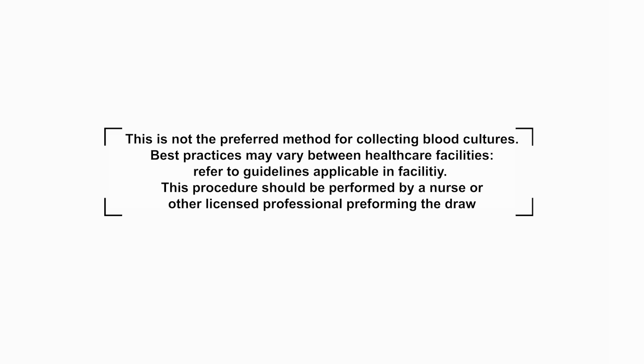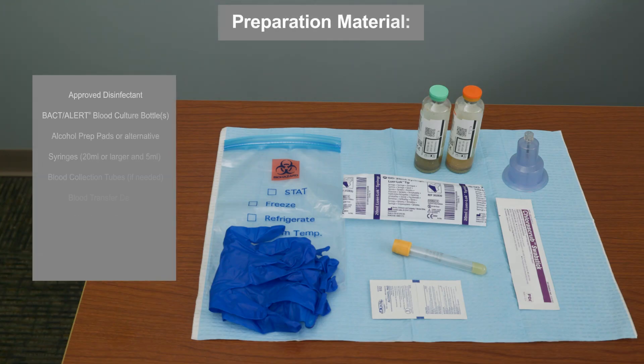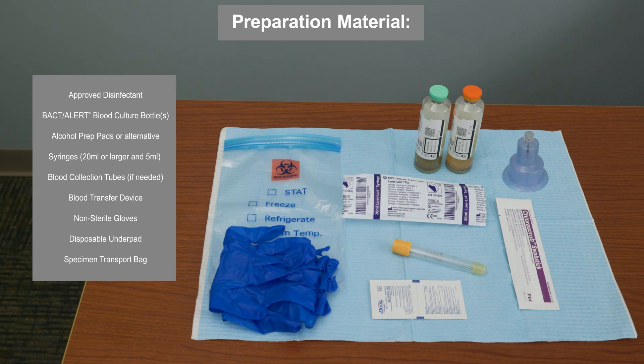This is not a preferred method since the chances of contamination are increased significantly. A properly collected blood culture sample free of contaminants can help to ensure accurate results that can improve patient outcomes.